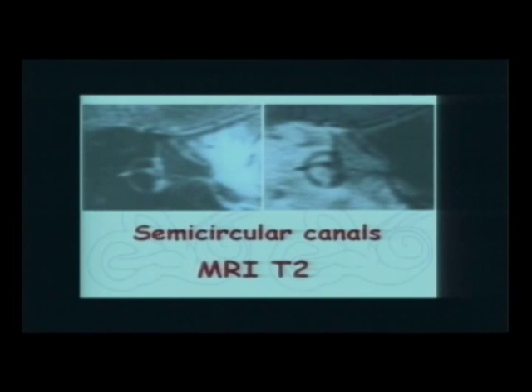Why is this cochlea, for example, posteriorly placed? Why is it too high? Why is it inferior? Because there's no cochlea similar from one patient to the other. As cochlear implant surgeons, I always go into every patient studying the direction of the cochlea, the lumen of the cochlea. Sometimes you find it small, especially in these kids with deafness. You have structural anomalies that you can see very nicely on a 3D view of the MRI.